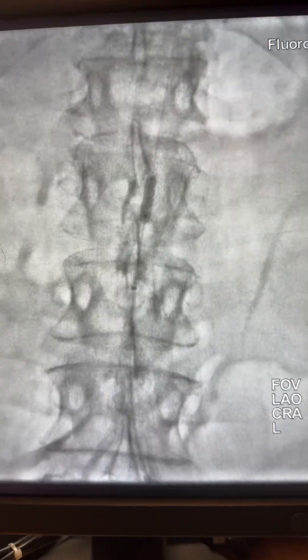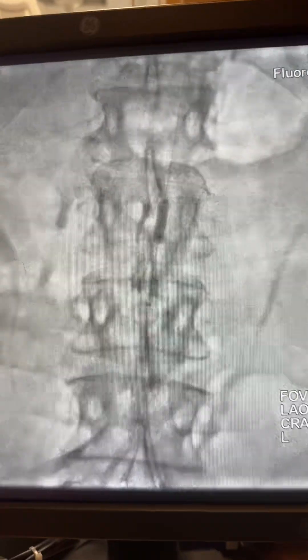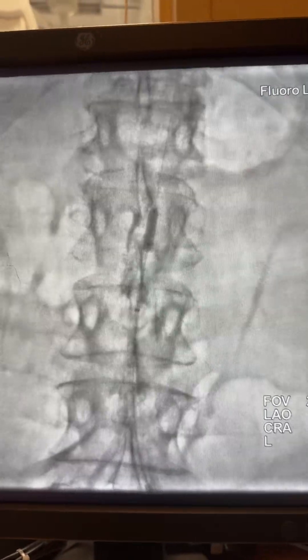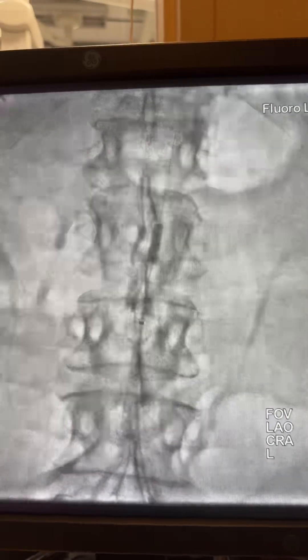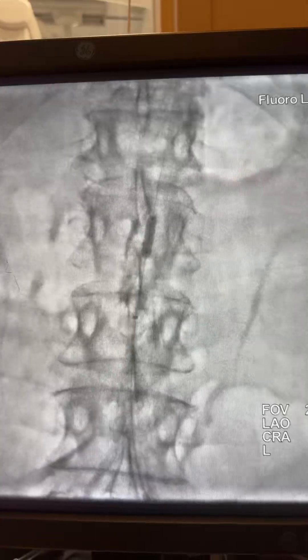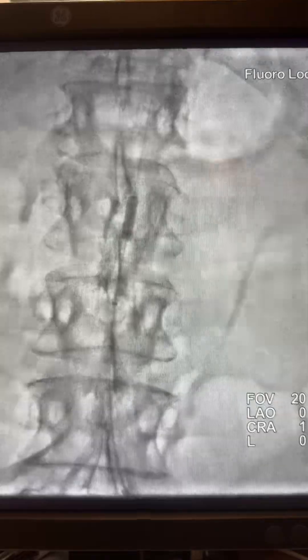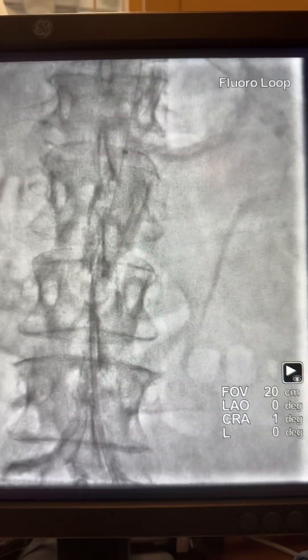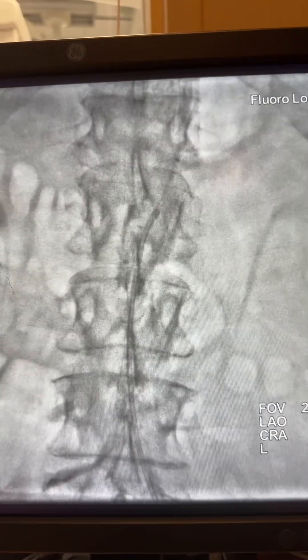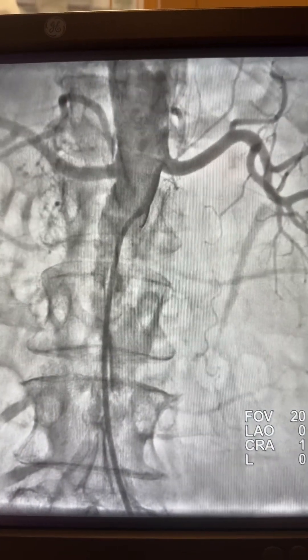Following that, I performed shock wave lithotripsy using the same 5.0 lithotripsy balloon in the aorta. Again, this is 6 French, so that's the maximum I can do for this sheath — multiple shocks and inflations obtained. The guideliner and guide catheter were advanced and here is the angiogram beyond the lesion.